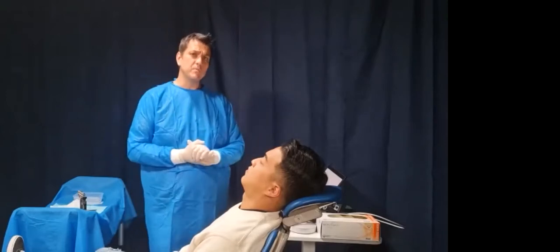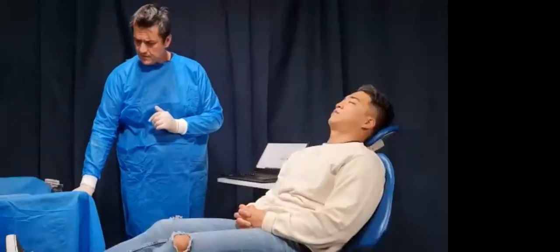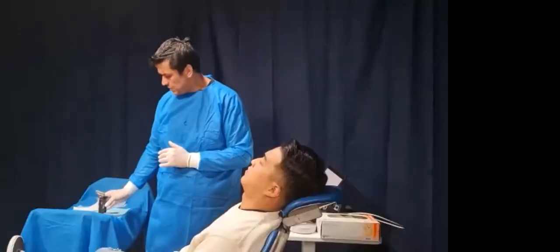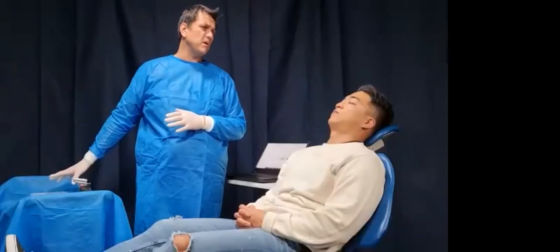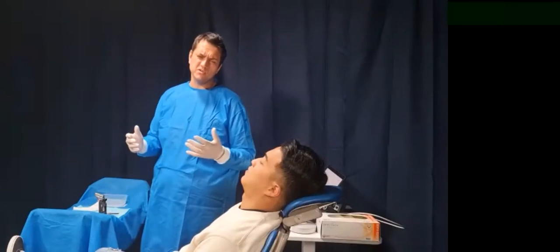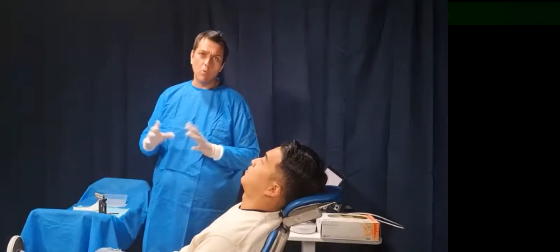Okay, so here's what we're going to do. First thing we're going to do is, I've got some wax. I've got my little trolley here. Now my little trolley, I've got a couple of things. I've got my little burner, wax knife if you need that. I always have a little bit of cold water close by because I like to cool down the wax as quick as possible. I know that poses shrinkage, but again, you're coming in and out of the patient's mouth. It verifies every single time anyway, so I'm not worried about that.